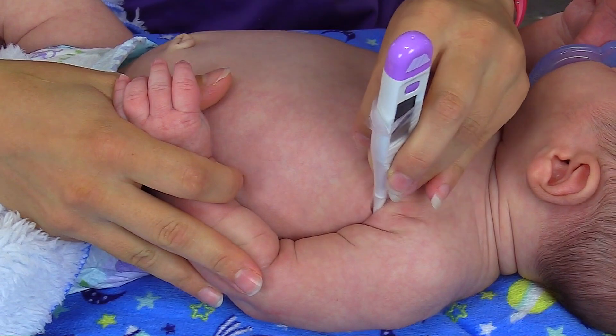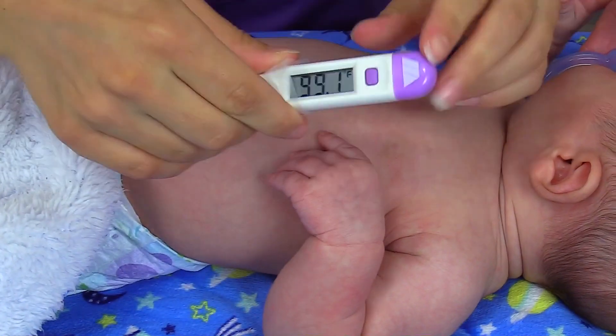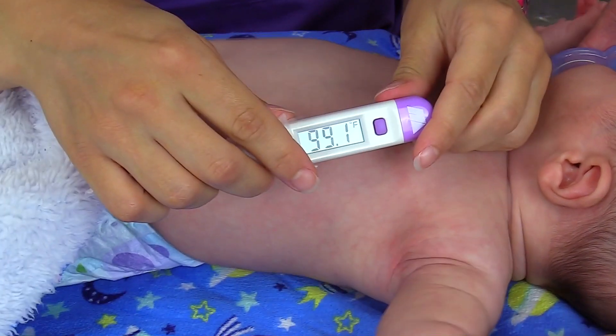Our thermometer is beeping so it is done, and the reading is 99.1. We would document this, and this falls within normal range.